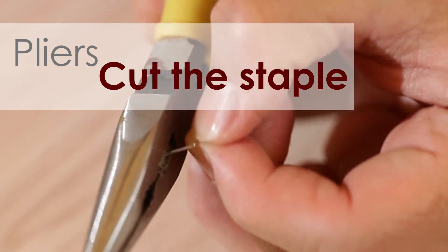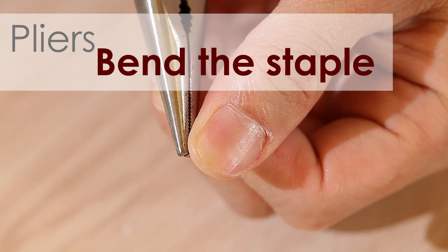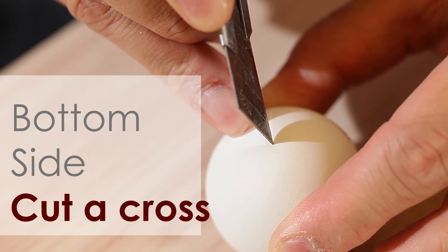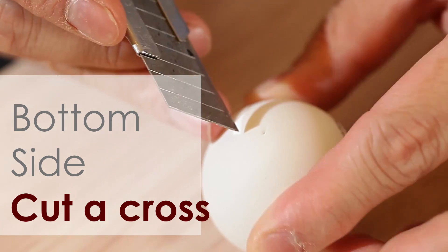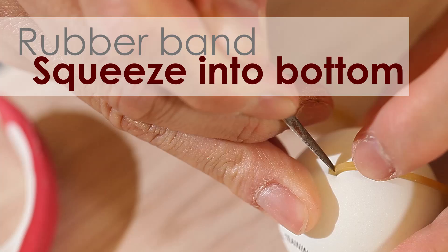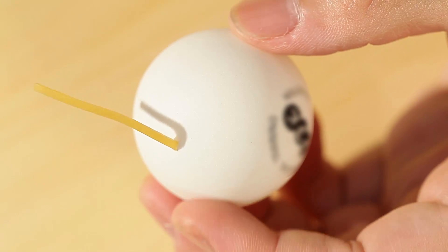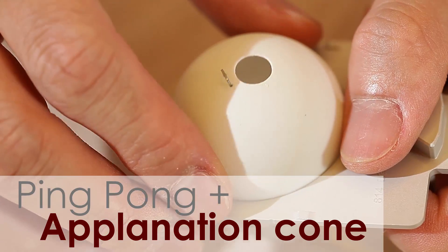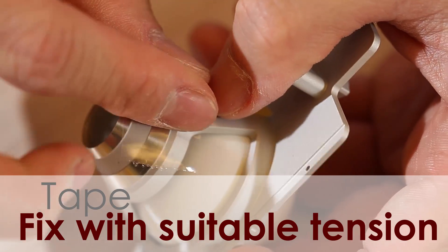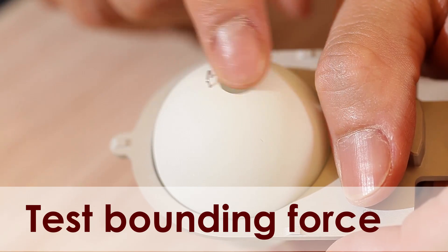Cut the end off of a staple. Bend the staple into a U-shape about 2.75 mm wide. Cut across into the other side of the ping pong ball. Insert a rubber band into the cross. Put the ping pong ball into the patient interface cone that is used in LASIK. Fix the rubber band with tape, giving it suitable tension. Test the bounding force of the eye model.